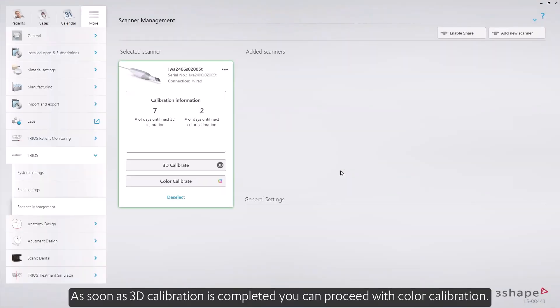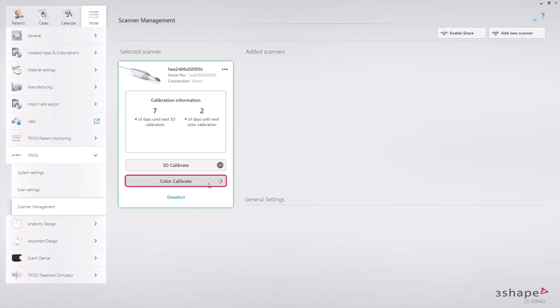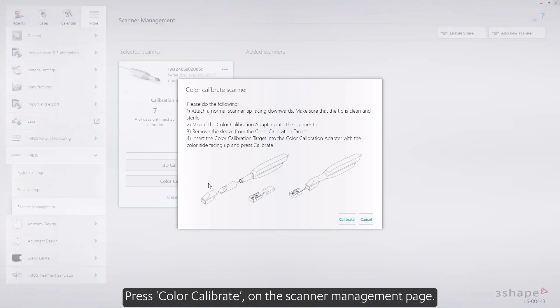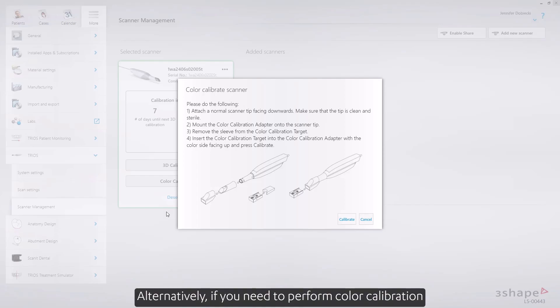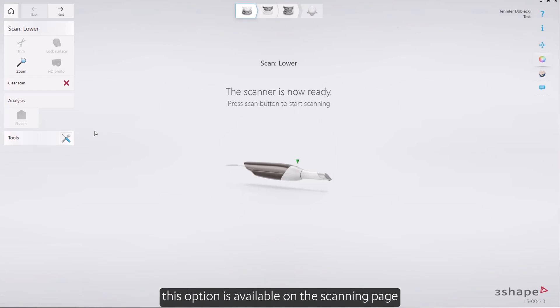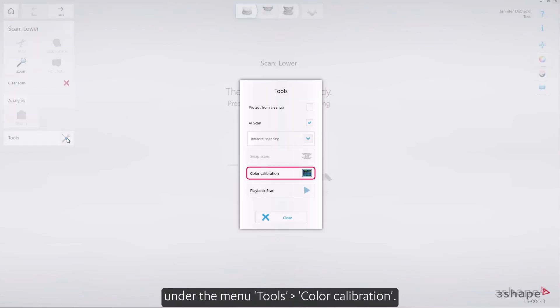As soon as 3D calibration is completed, you can proceed with color calibration. Press Color Calibration on the scanner management page. Alternatively, if you need to perform color calibration when you've already begun working on a new order, this option is available on the scanning page, under the menu Tools, Color Calibration.